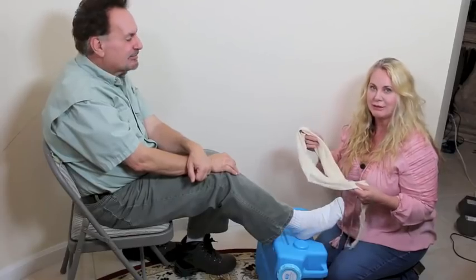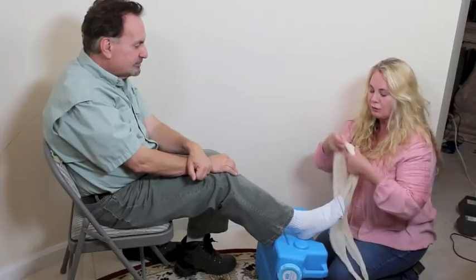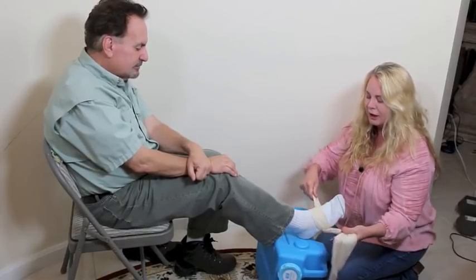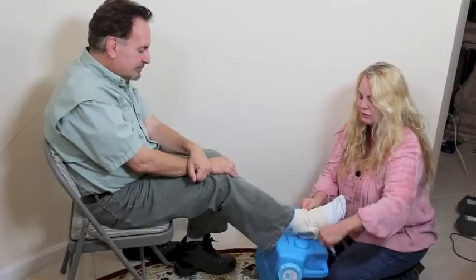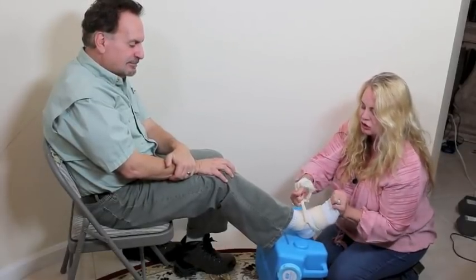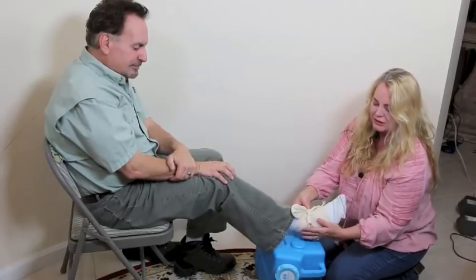Nurse Amy will now demonstrate on an antique dummy how to stabilize a sprained ankle. We've removed the boot because the triangular bandage isn't quite long enough to keep it on. Fold the bandage up to about three or four inches so it doesn't cut into the skin. Go across the top of the foot, cross on the bottom, go to the back of the ankle, cross there, come to the front again crossing, take the excess and go underneath the sides, then tie it on top of the foot.